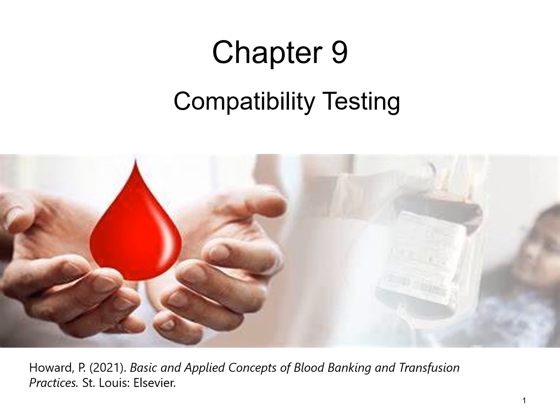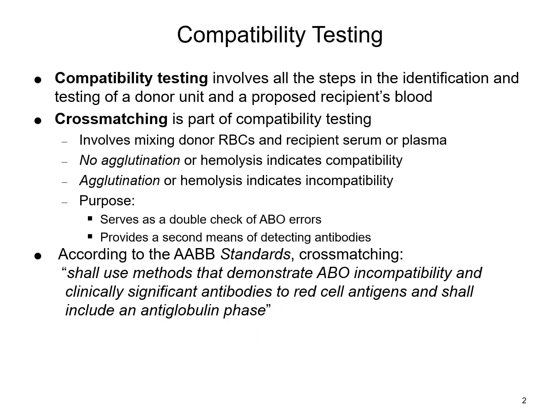For this lecture, we will discuss Chapter 9, Compatibility Testing. So in the world of transfusion medicine, compatibility testing involves all the steps that are used in the identification and the testing of a donor unit, as well as the possible recipient that will be receiving that donor unit.